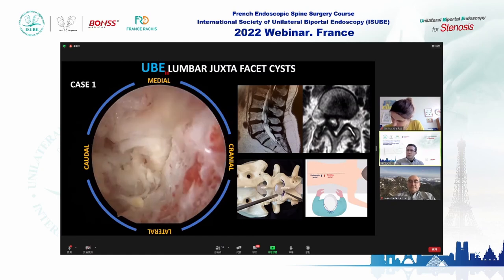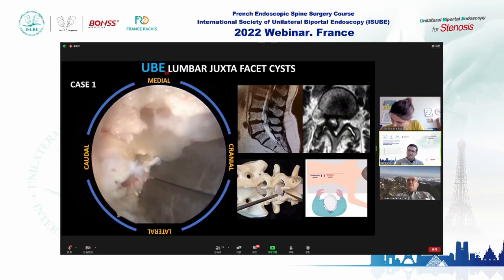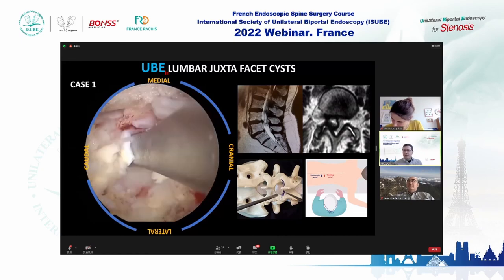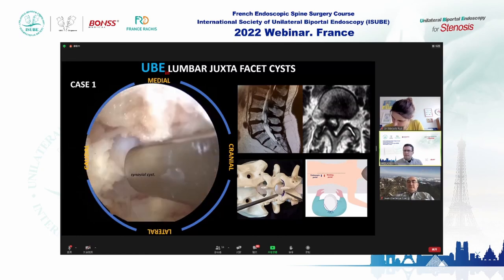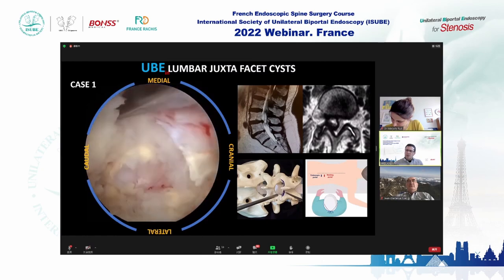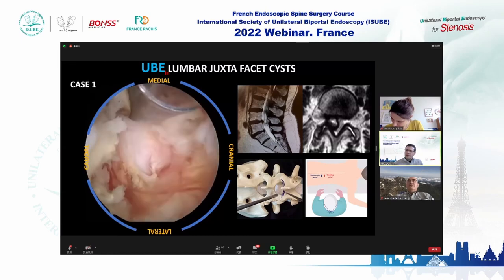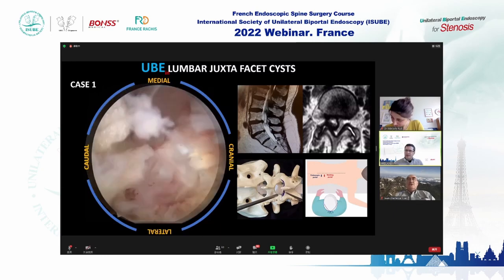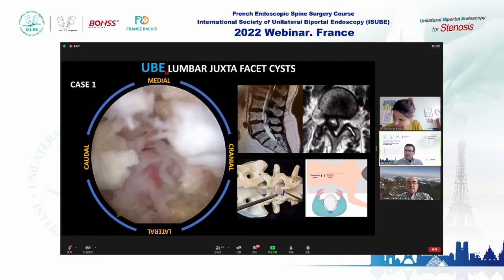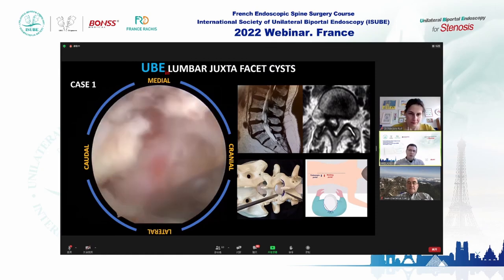I decide to open more flavum ligament and remove the posterior wall of the cyst. We open all of the cyst — this is only the contents. I try to detach the cyst wall from the dura, but the dura is strongly attached to the wall. So I abort — I stop the surgery. More than 50% of the cyst has been removed. We decompress all the lateral recess, and the patient goes home the same day.